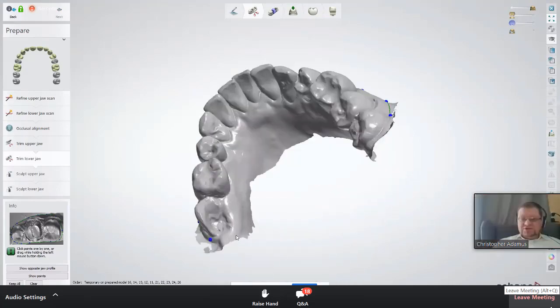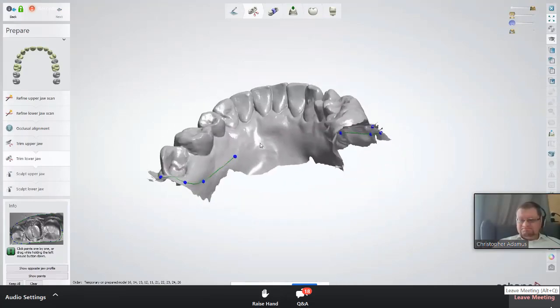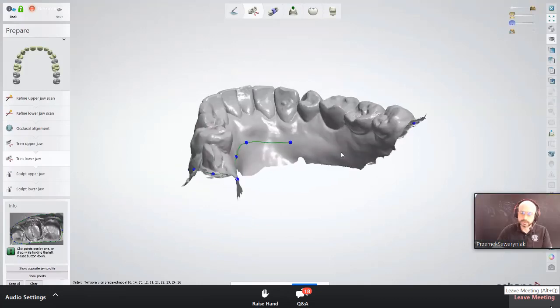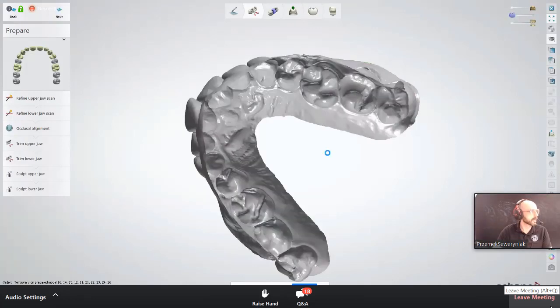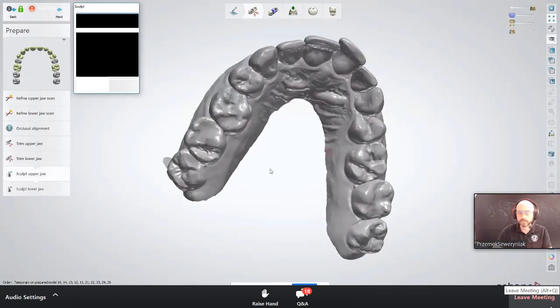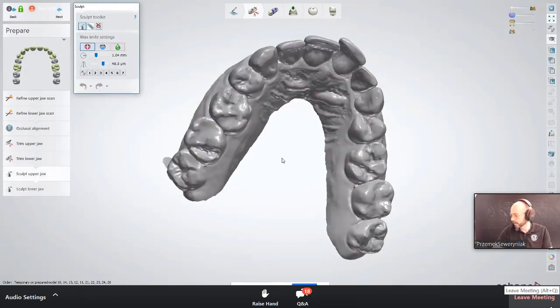Is it possible to use a smile design for lower jaw? Not yet, but hopefully it will be in the future. What type of a flash are you using? In these pictures you saw here, it's studio lights, so it's soft boxes, like 60x90 or octabox. And otherwise I try to use the Nikon RBD flashes, so 2 flashes on the side.